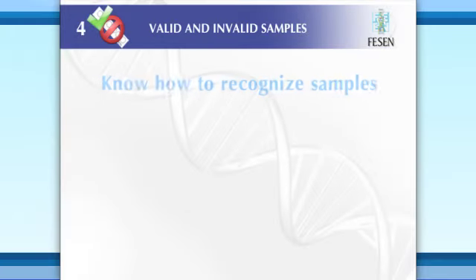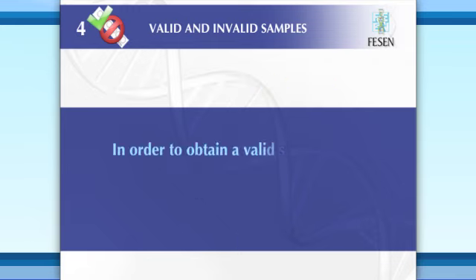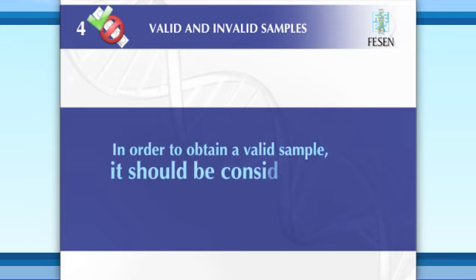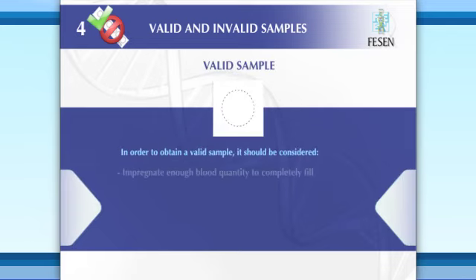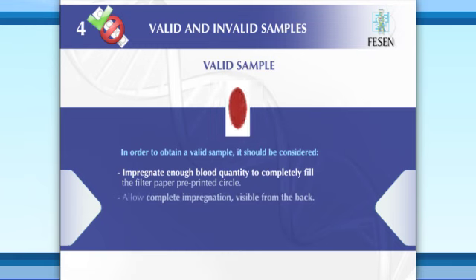It is very important to distinguish between valid and invalid samples to avoid repeating the procedure and delaying the diagnosis. In order to obtain a valid sample, it should be considered: impregnate enough blood quantity to completely fill the filter paper pre-printed circle. Allow complete impregnation, visible from the back.